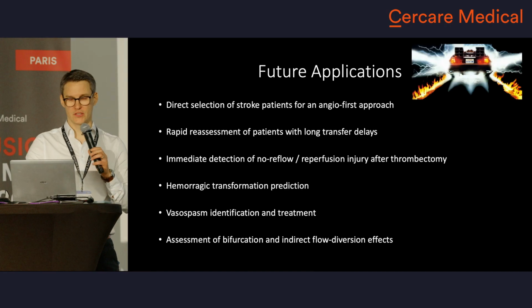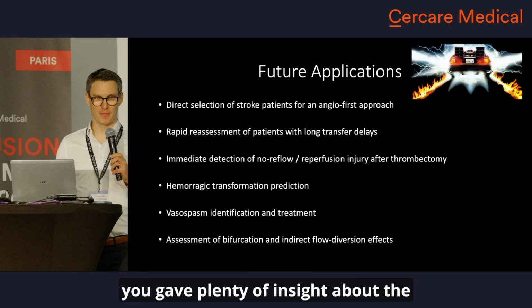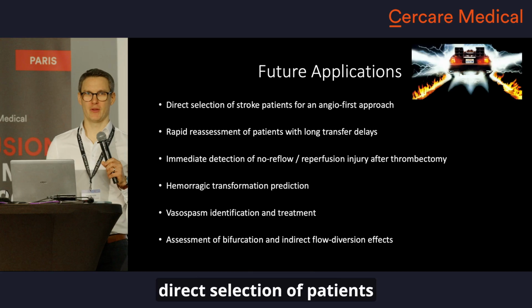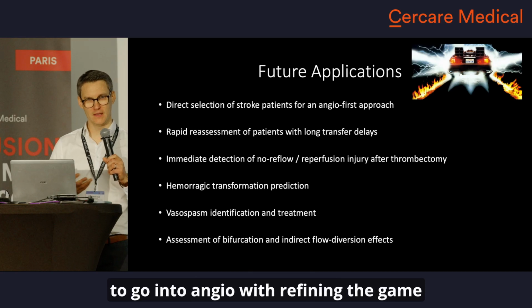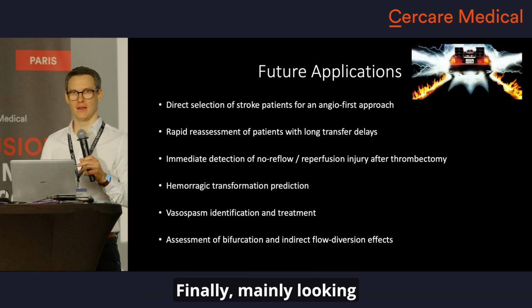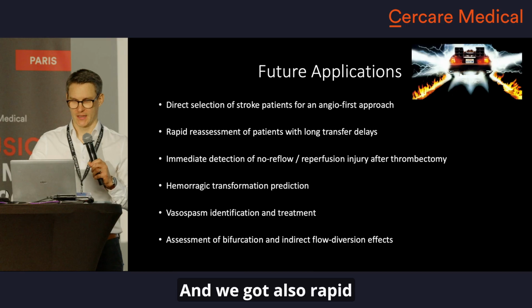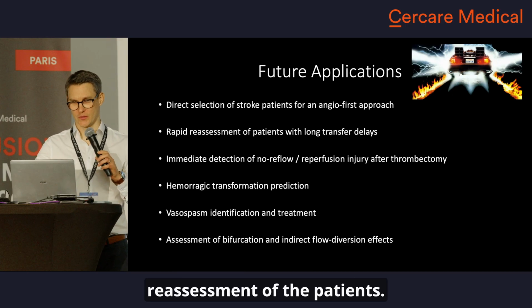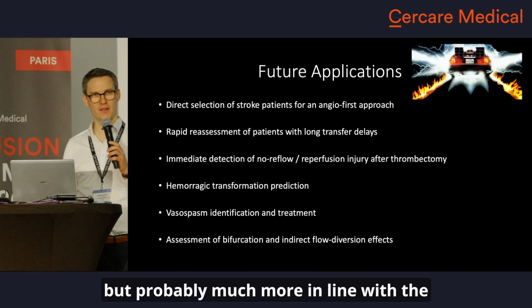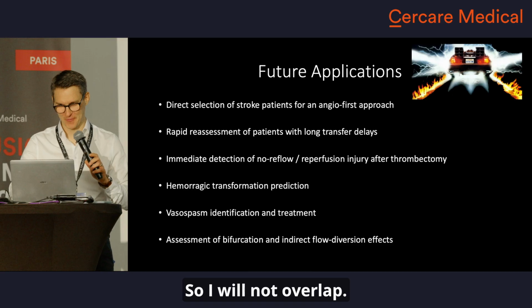Oh, sorry. The future applications. Most of the speakers this morning gave plenty of insight about the future applications. So we've seen the direct selection of patients to go into angio, refining the game and changing the parameters for defining core and penumbra, mainly looking at CMRO₂, OEF, etc. And we got also a rapid reassessment of the patients. It's the same. The detection of no-reflow, as Ettore spoke, but this is much more in line with the talk this afternoon, so I will not overlap.